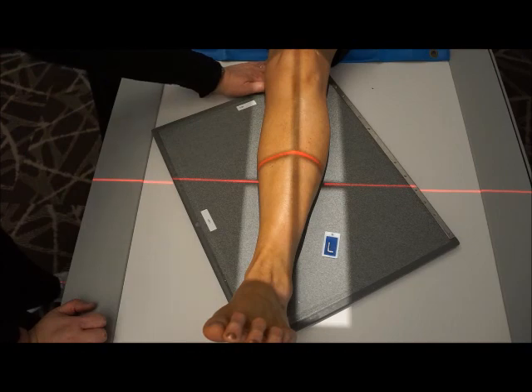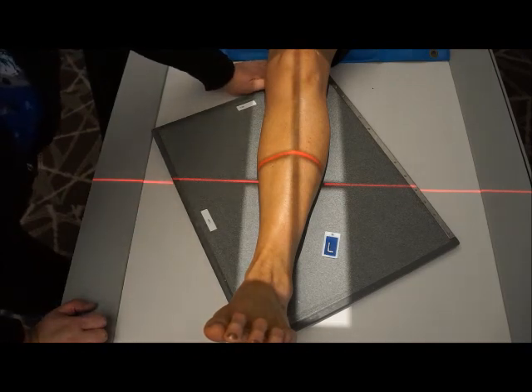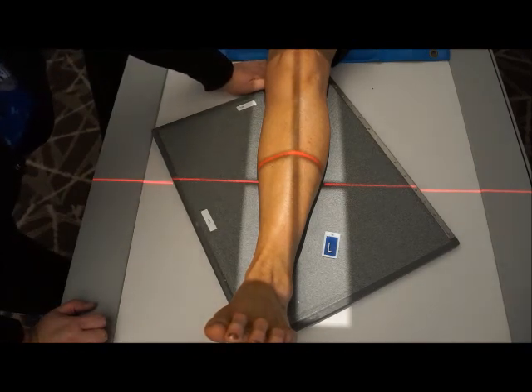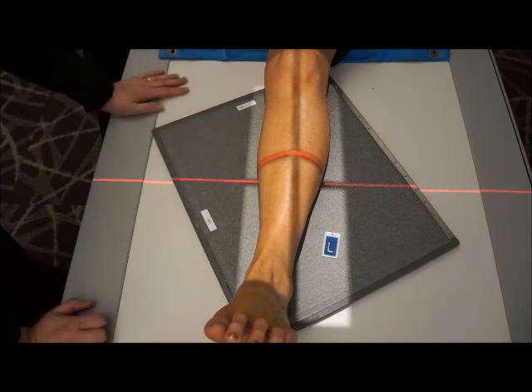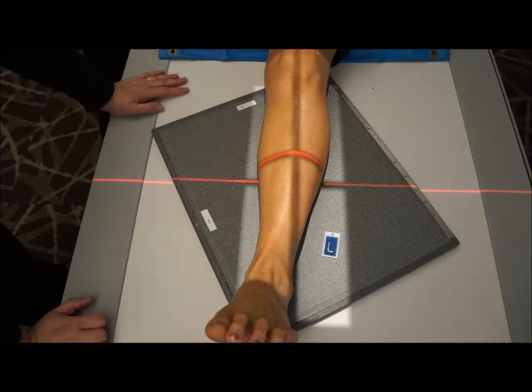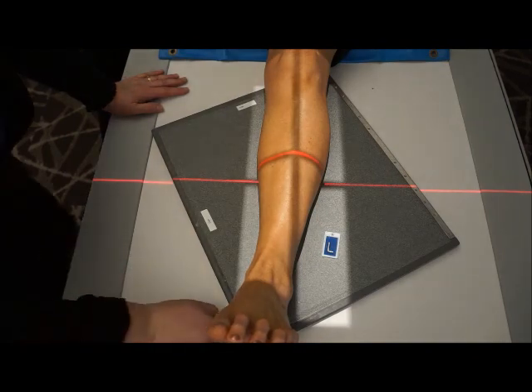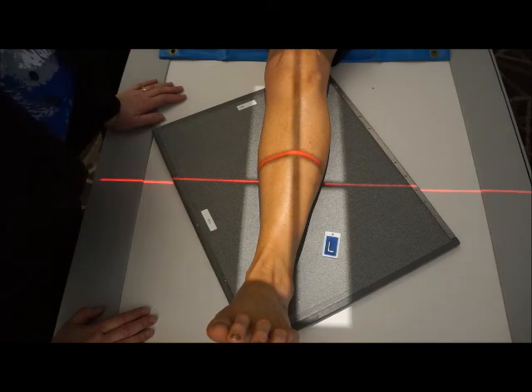The image receptor will be at the corner of it. We're using it diagonally, so it'll be about the center of the knee joint posteriorly. You can see we've got collimation open to ensure that we're getting both corners of the image receptor.